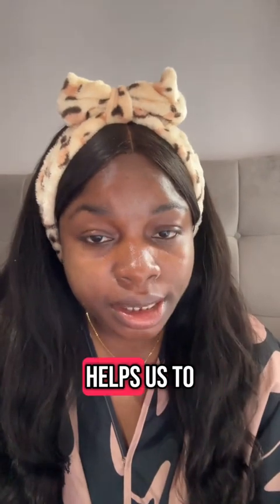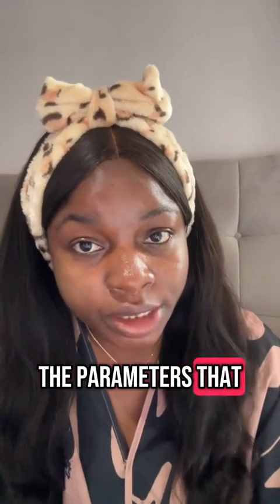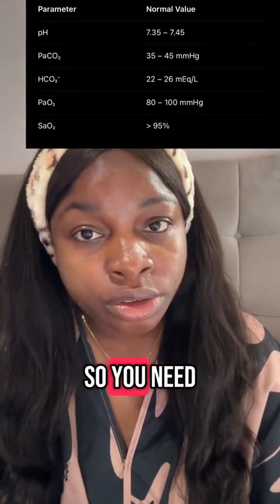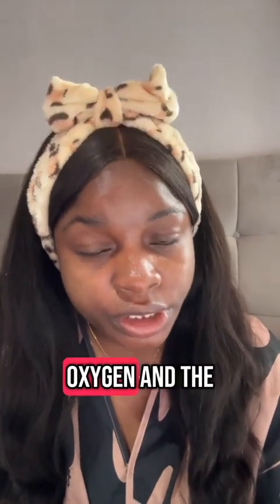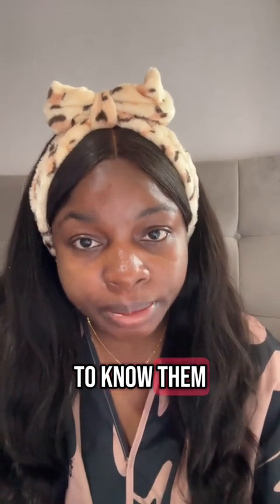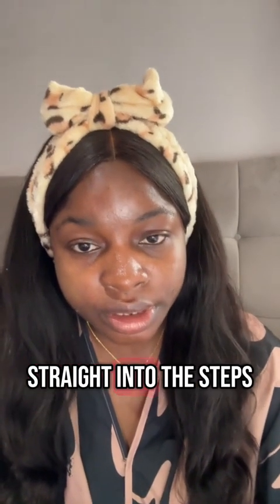Arterial blood gas helps us to know the acid-base status and oxygenation, and I'll be leaving you the parameters we'll be working with and their number range up here. You need to know the number range for pH, bicarbonate, CO2, oxygen, and the rest, and you need to know them very well, because without knowing the number range, you won't be able to interpret arterial blood gas. So let's go straight into the steps.